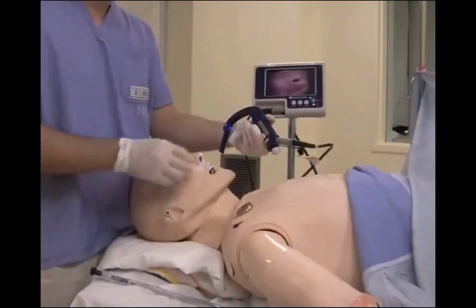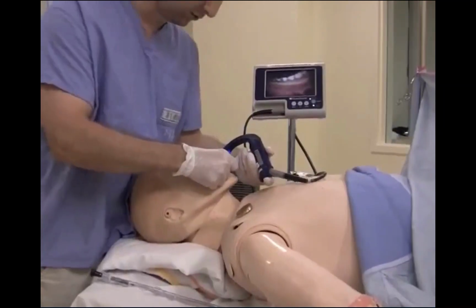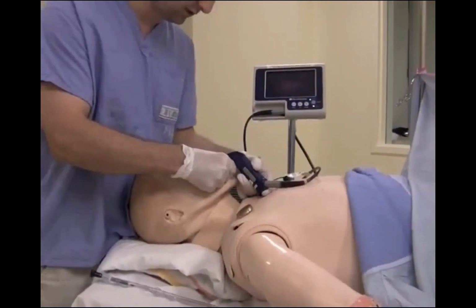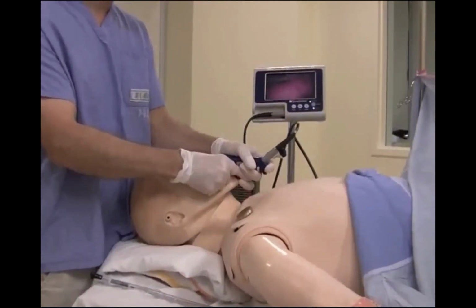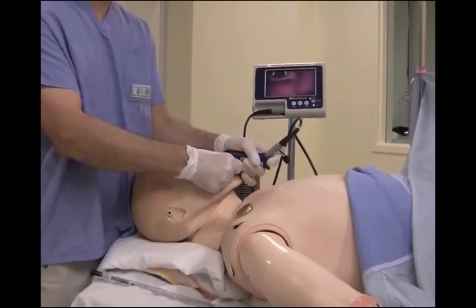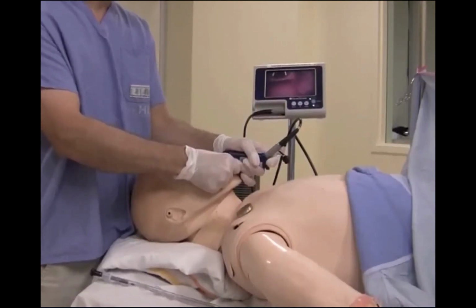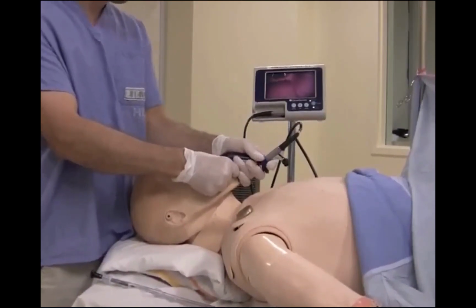For insertion of the Glidescope handle, what I will need to do is open the mouth and look directly inside the patient's mouth in order to avoid damaging teeth, as well as to navigate around the tongue. I can then look at my screen to look for some recognizable structures. Here at the top of the screen, you see that the glottis is coming into view, with the vocal cords being white and the entrance to the trachea being the dark circle in the middle.